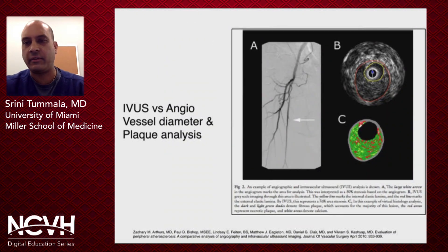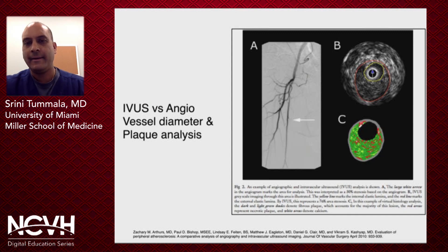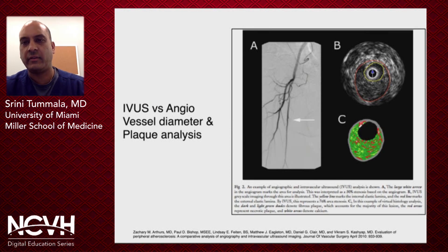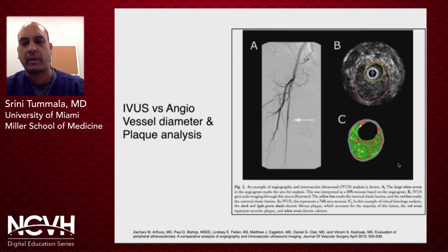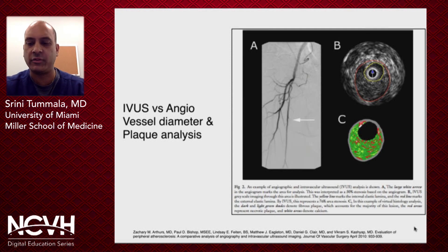Here's another example of IVUS versus angiography. The angiogram looks like there's really no focal hemodynamically significant stenosis, but when you look with IVUS, you can see not only significant fibrous plaque but also significant reduction of the lumen. A lot of this plaque is fibrous in nature with some areas of necrotic plaque and minimal calcification. It gives you much better visualization and analysis of what's really going on in a vessel you're trying to treat.